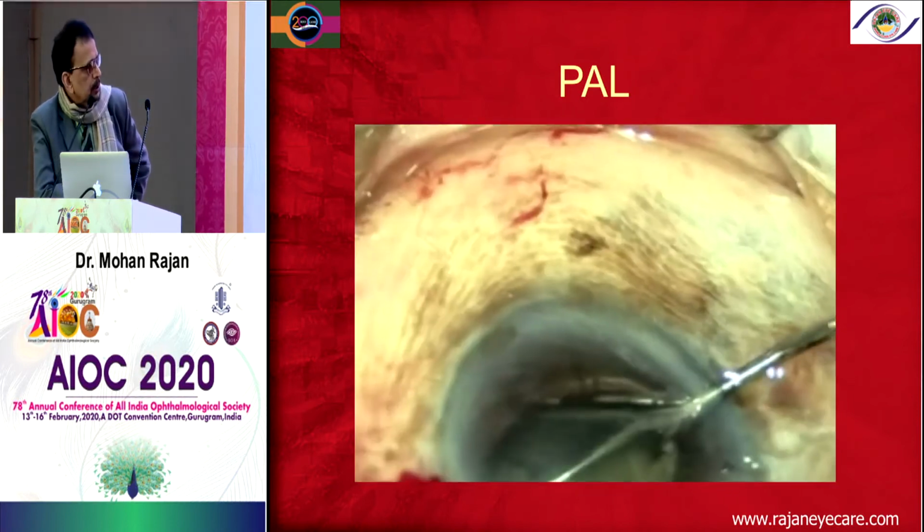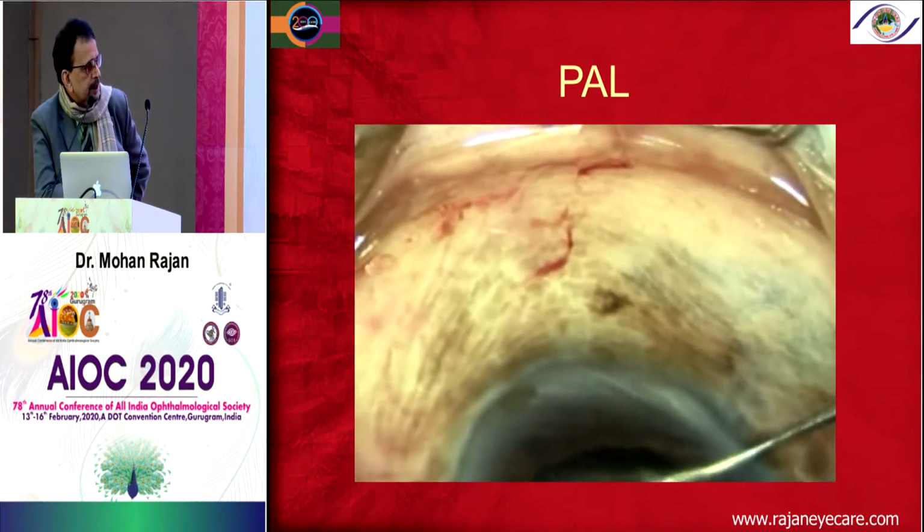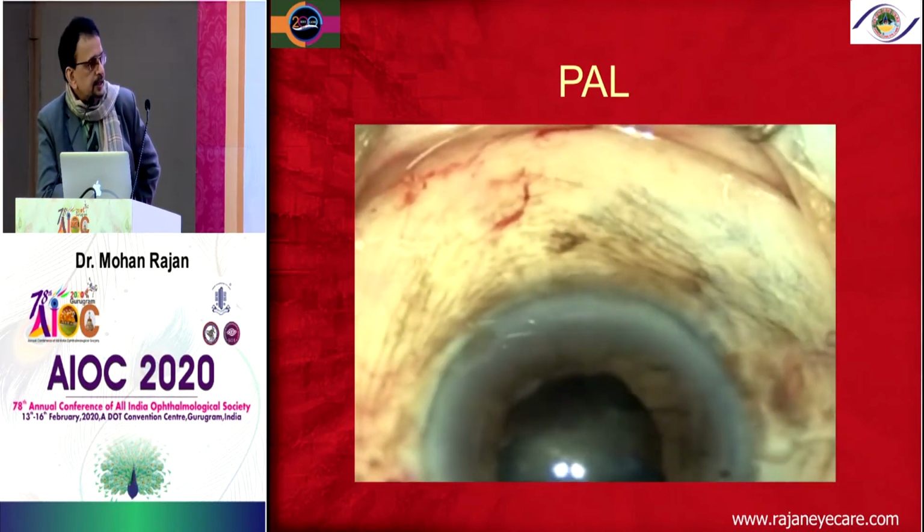And you can see here the nucleus started sinking into the vitreous cavity, but it's not gone fully inside, it is still there.